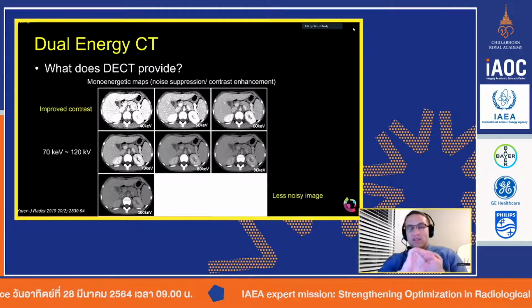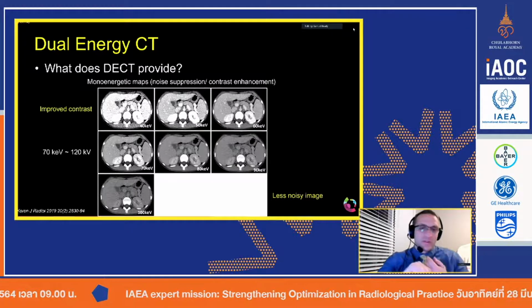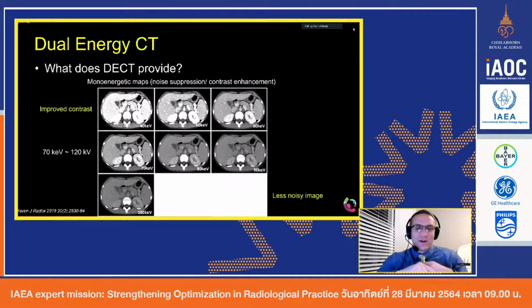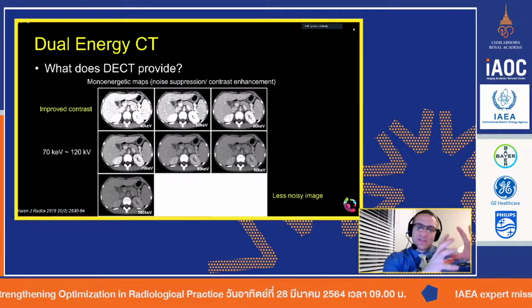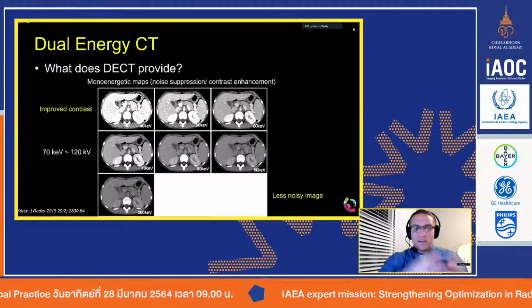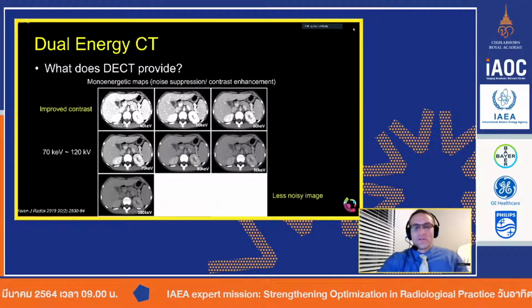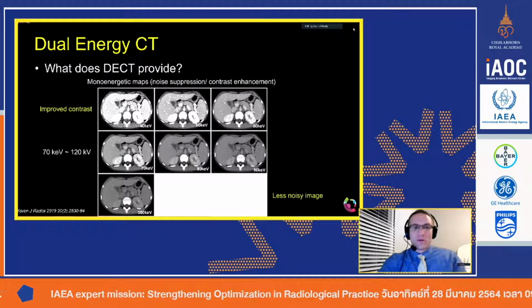This is one of the benefits where, in my opinion, identification of uric and non-uric in pediatrics is really not that big of a deal, and hopefully we're not really dealing with gout with kids. Some may have arthritis issues, but for the most part, those tend to be usages or protocols that we would create for adults. As a pediatric physicist, everyone asks me, what do you use dual energy for in kids? I tell them this is one of the main reasons.